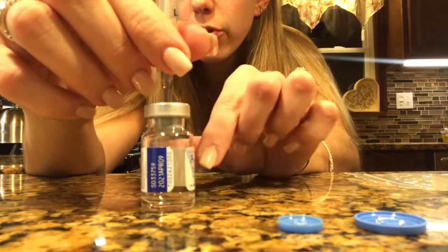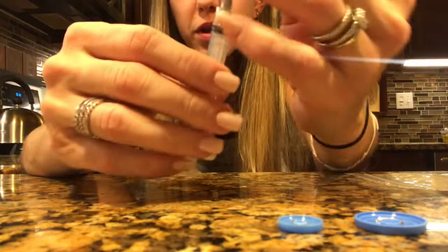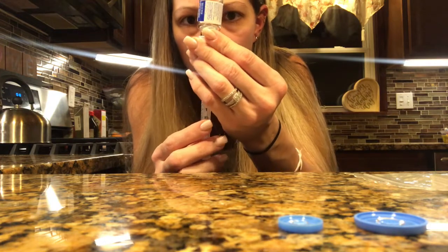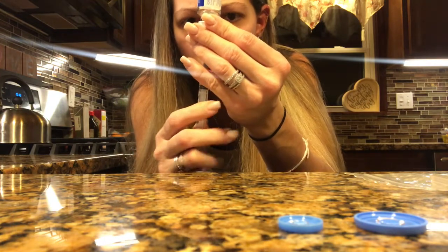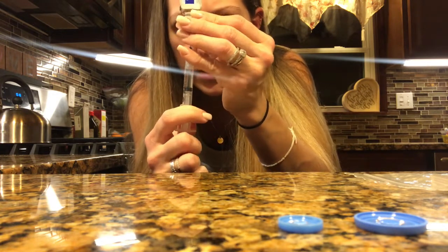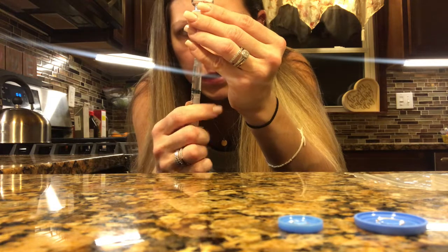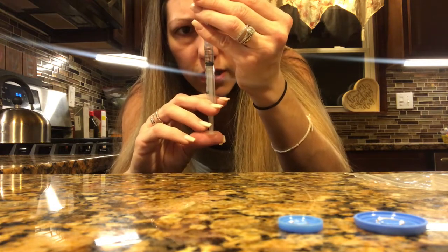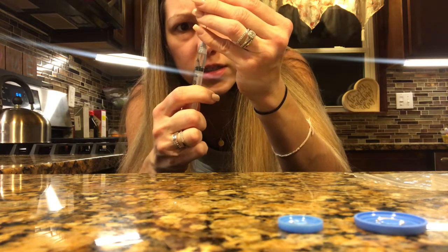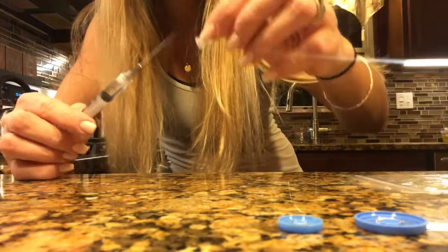I'm just shaking it a little bit — it looks to me like it is completely dissolved. Since I'm doing 10,000 units, I'm going to pull back all of the liquid. Tip the bottle, make sure your needle is pulled all the way down, and draw back all of that liquid that is in the bottle. Push the air back up and make sure all the liquid is pulled in.